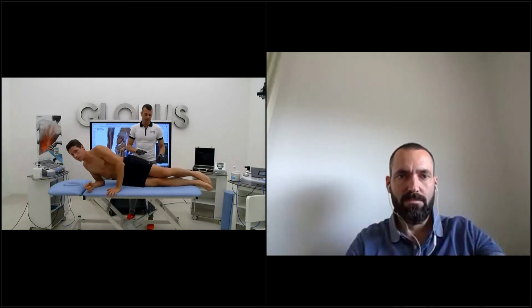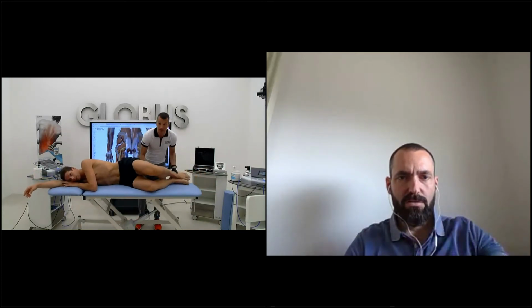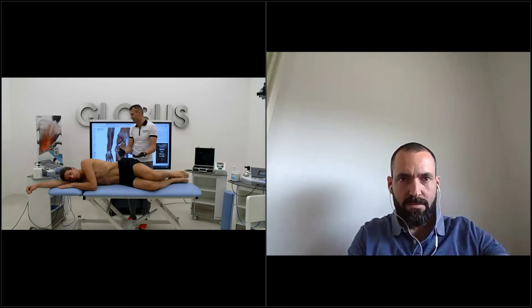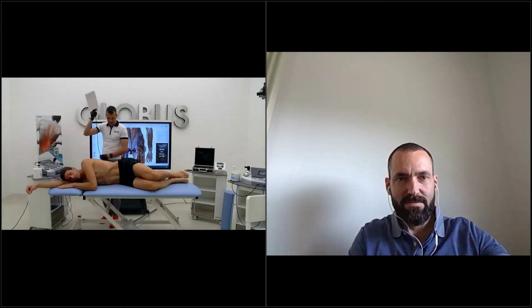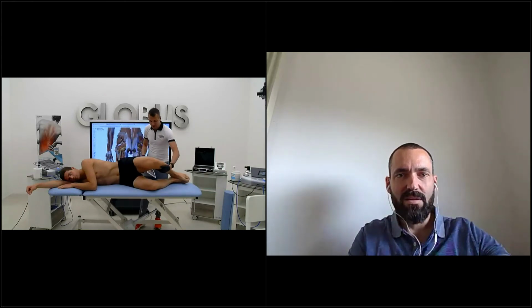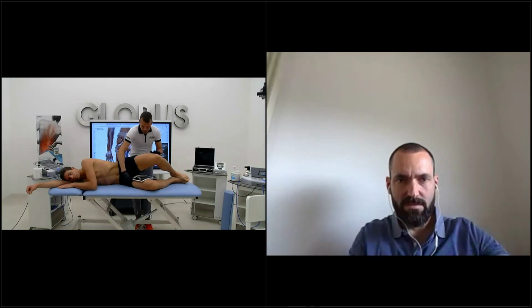Where do you usually put the blade? In the lateral? Yeah, usually I put a towel between the legs and the plate under the left leg, between the legs. Okay, perfect. It's what I used to do. Great. Yeah, this is a good way to put the plate. Yes, we can put it here or under here. But if our focus is this part of the hip, I suggest to put it under the hips. I prefer this way because it is closer.